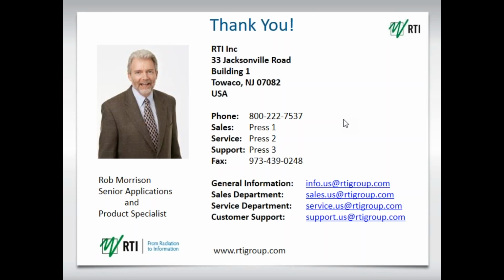And there may be some service releases as well in between, but the 2 major releases are typically twice a year. And one of the nice things is if you have Ocean software, you can actually check for updates if you're connected to the web. When you start Ocean, if there is a new update, it'll prompt you and say there is a new update of software available if you'd like to get it.